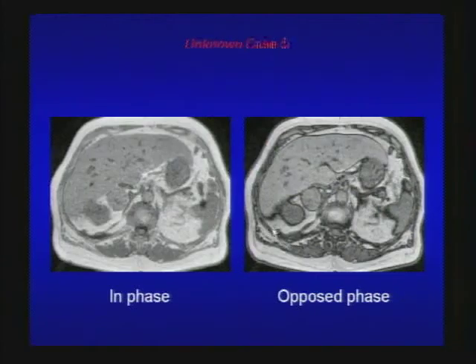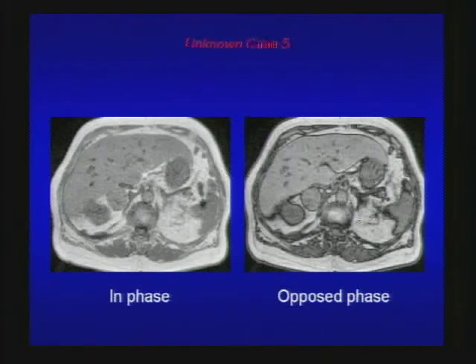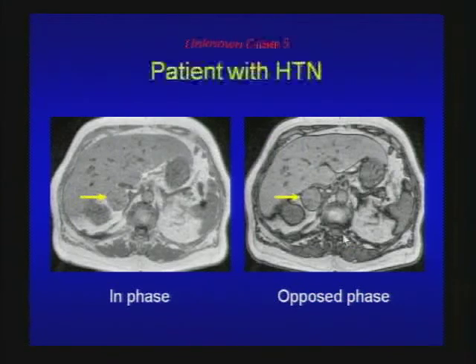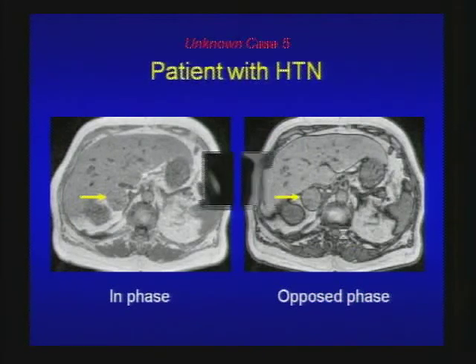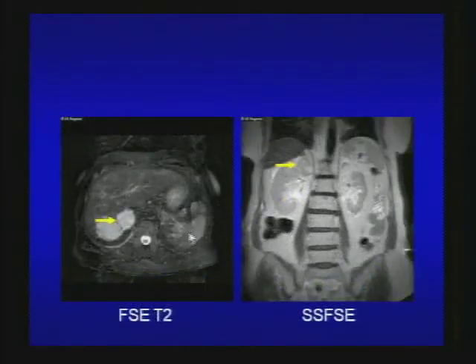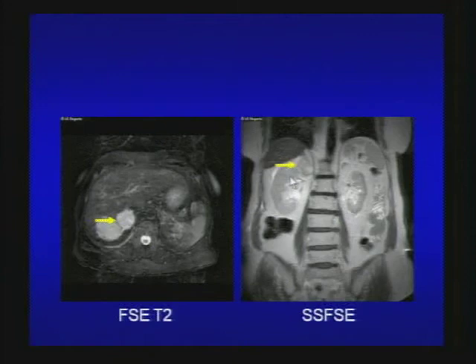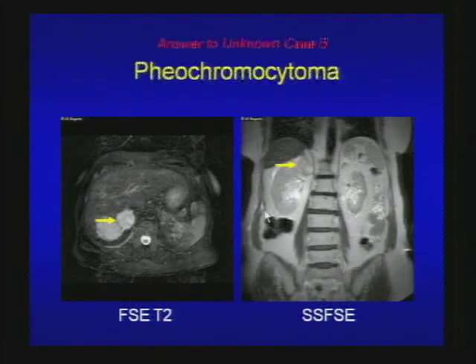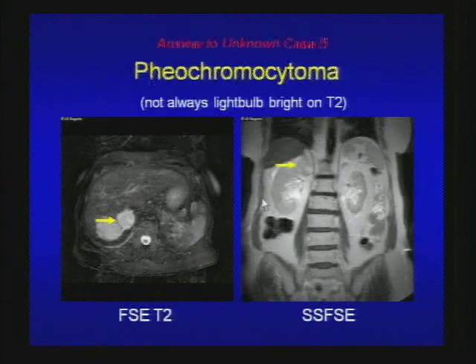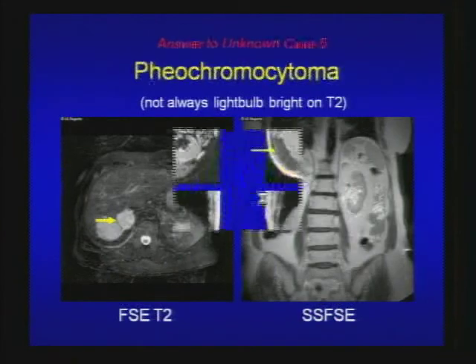Here is unknown case 5: right adrenal gland mass with no significant signal dropout on opposed-phase image when compared to spleen or skeletal muscle — not typical for adrenal adenoma. This patient has hypertension, and on additional images it's fairly bright on T2-weighted image but not quite light bulb bright. This is a case of pheochromocytoma — not always light bulb bright on T2.